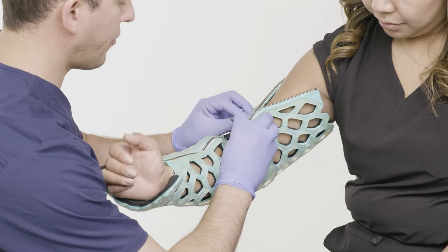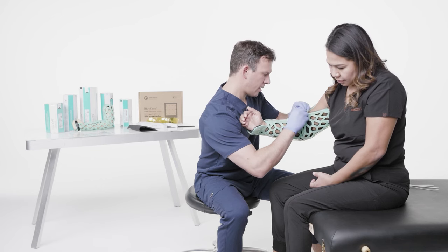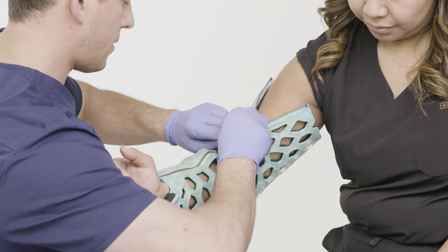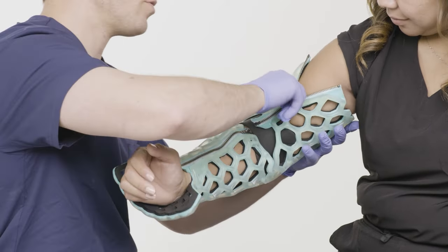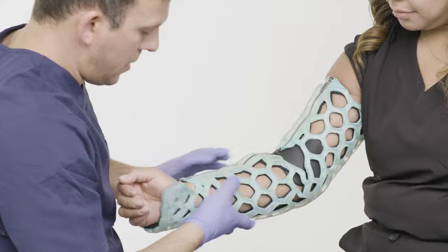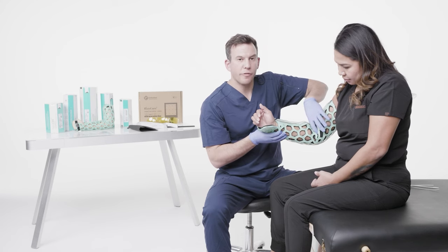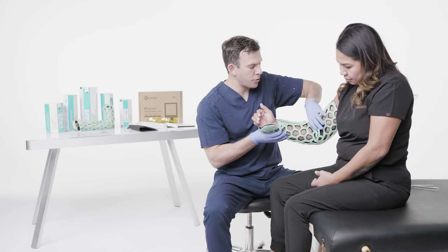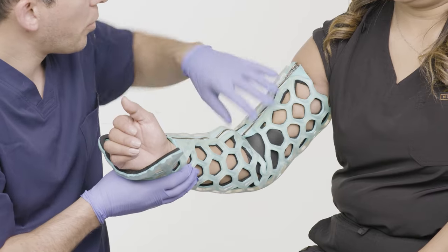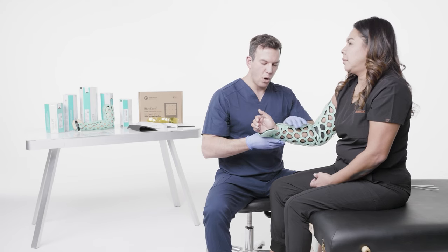I can finish zippering, add a little bit of traction, and pull all the way up. Making sure that is nice and protected in that cubital fossa — when I fold this up, that's going to fit in there nice and snug. Make sure your patient stays at 90 degrees, and make sure you don't catch the patient's skin with a little bit of traction. I'm at 90 degrees, I have my zipper on, my cubital fossa is nicely protected, and all the sensitive structures in there — the medial and lateral epicondyles — are also protected. It's nice and snug on the biceps region and on the forearm region.